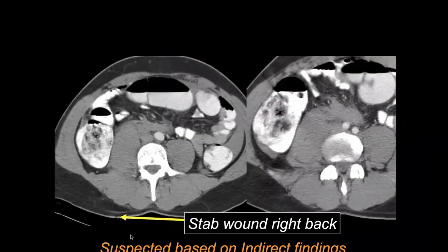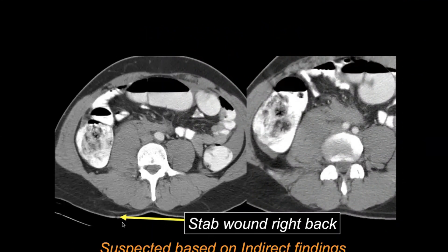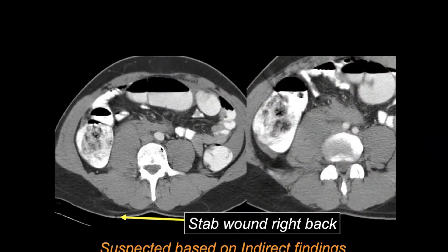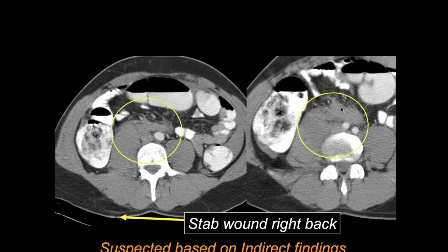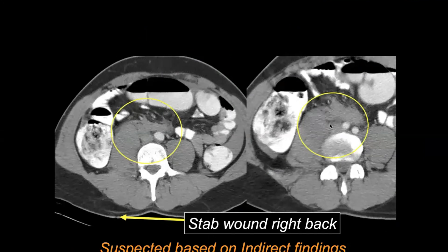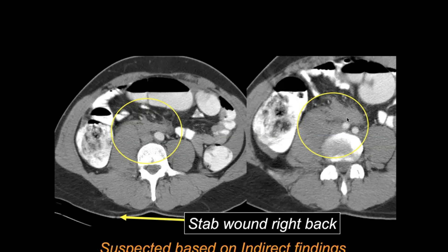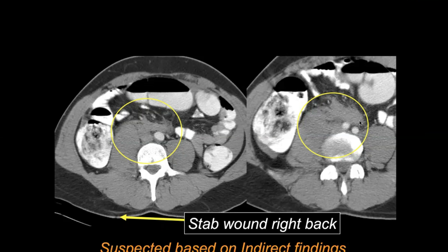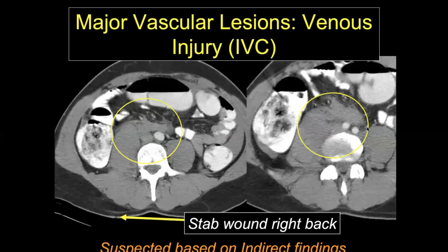A companion case: a patient who was stabbed in the right back. Note retroperitoneal hematoma; the IVC is not well delineated. There is no evidence of active arterial extravasation, but based on these indirect findings, an injury of the IVC was suspected and later proven in the OR.